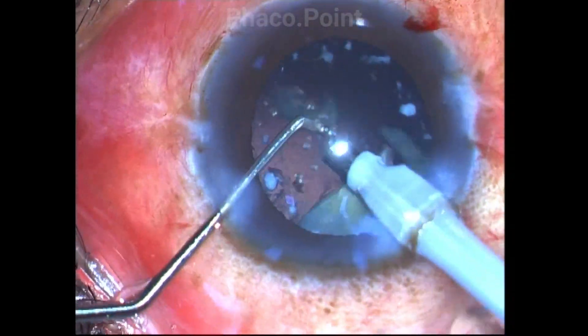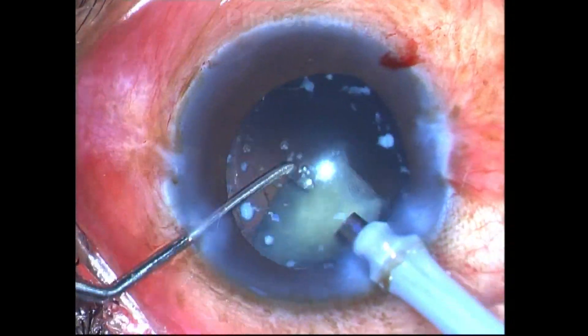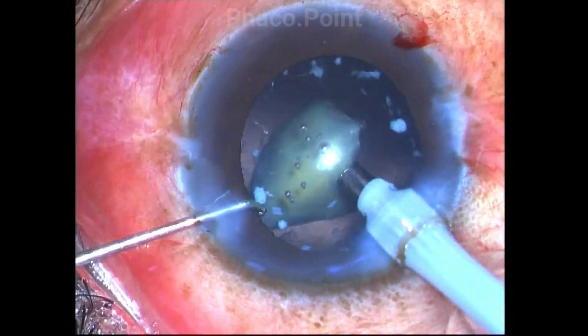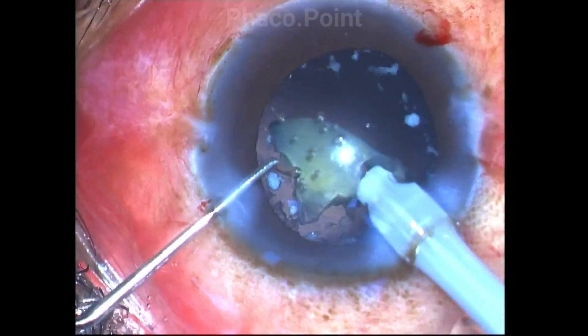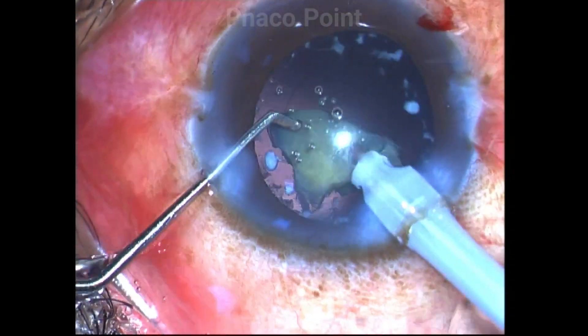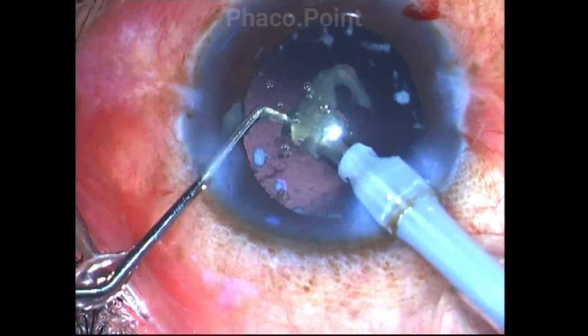These hard leathery Morgagnian cataracts have been bothering me for quite some time now, because even though I am predominantly a direct phaco chop surgeon, I find it very difficult to chop these very hard lenses. The horizontal chop, especially using a blunt chopper, has completely made my life very easy.